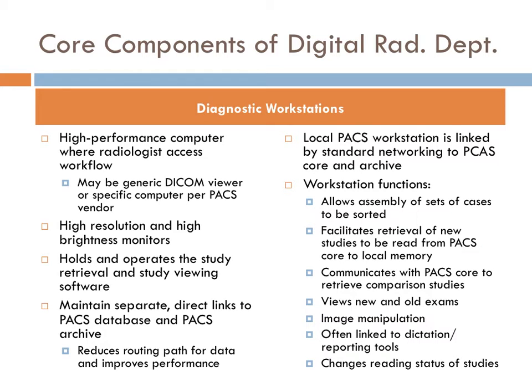So a diagnostic workstation has different functions. It allows assembly of sets of cases to be sorted, facilitates retrieval of new studies to be read from PACS core to the local memory, and it communicates with PACS core to retrieve the comparison studies. It views new and old exams. It can allow for image manipulation and is often linked to the dictation and reporting tools. And it changes the reading status of studies.